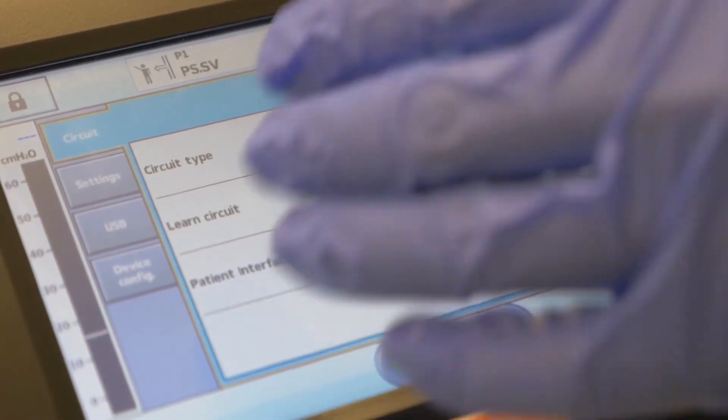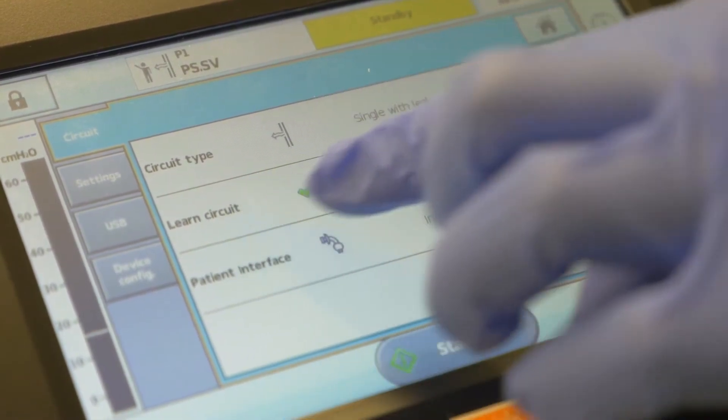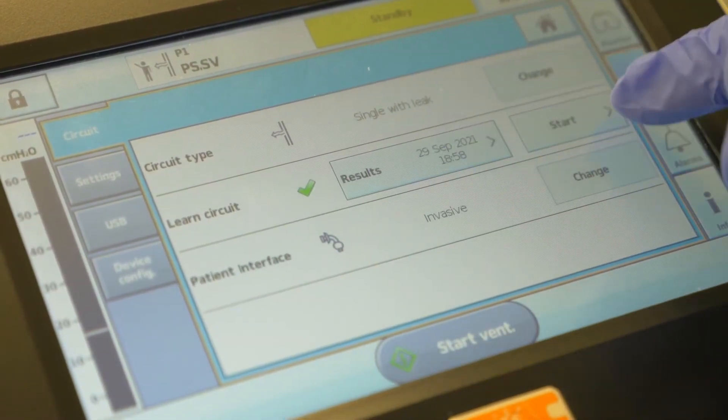After pressing the circuit option, look at the middle row for learned circuit. Note that you can see here when the last learned circuit test was done. This is a good thing to come back to check regularly.